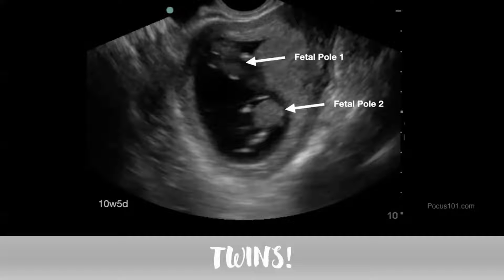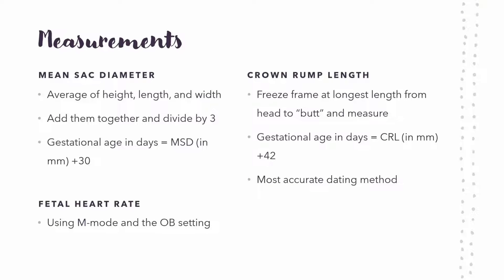Something else to look out for when you're doing this is twins — or I should say multiple pregnancies, because you could have more than just two. You can see that there are two fetal poles, which is pretty cool.